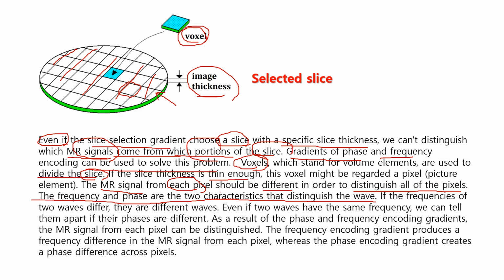If the frequencies of two waves differ, they are different waves. Even if two waves have the same frequency, we can tell them apart if their phases are different.